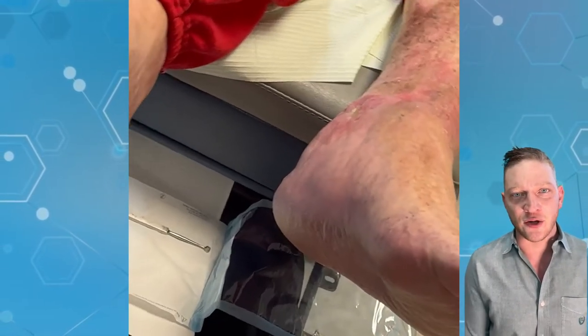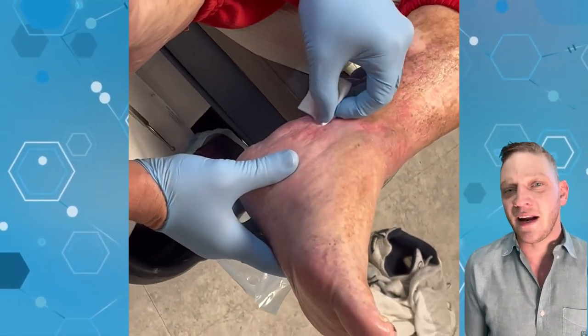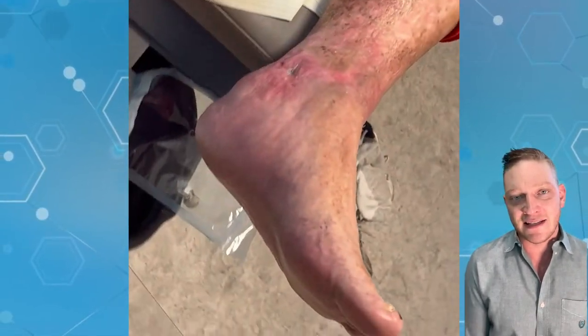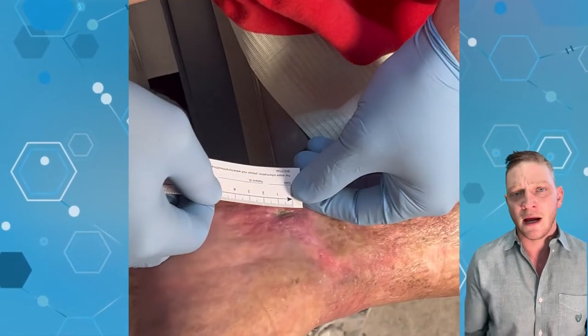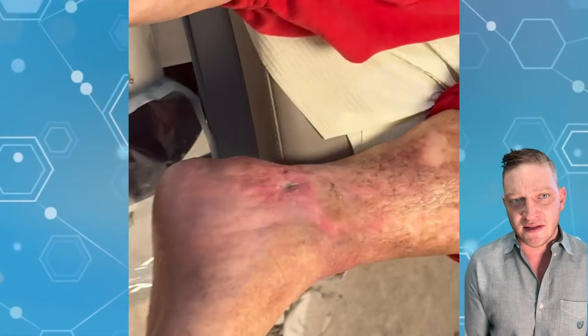Dr. Kilfoyle here with Podiatry Explained. Today we have a video of — actually, excuse me, not a diabetic wound — a lymphedema wound. This patient had venous stasis, meaning that his veins were not bringing the blood back up from his foot and his leg, and the blood pretty much tries to find the quickest way out. A lot of changes happen to the skin; you can see this hyperpigmentation.